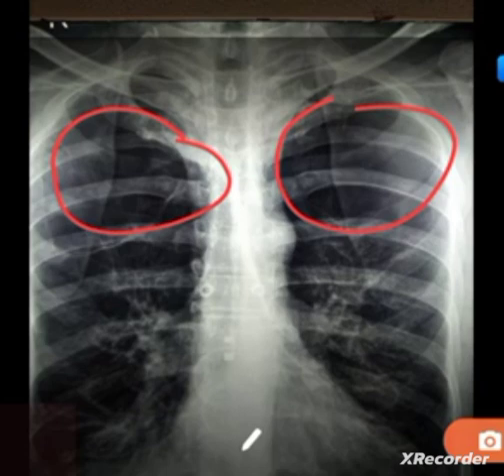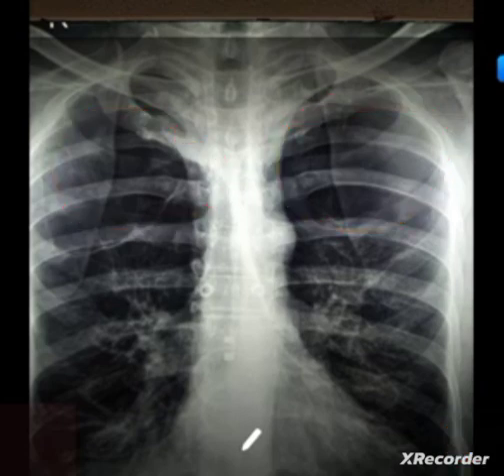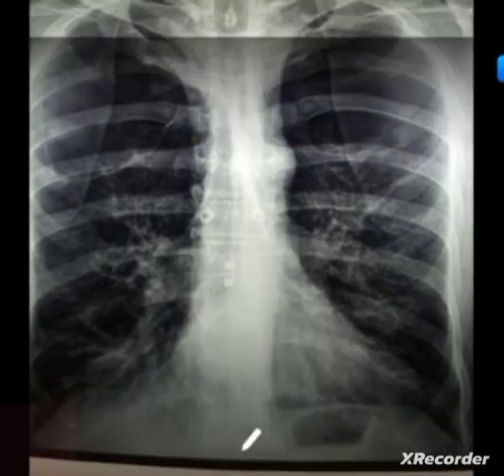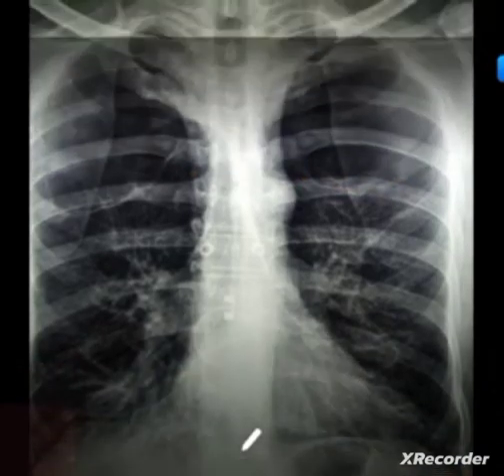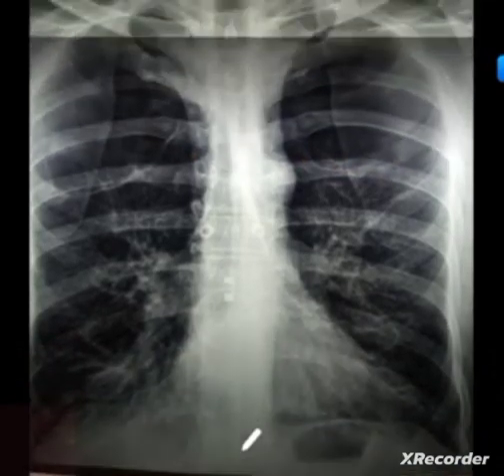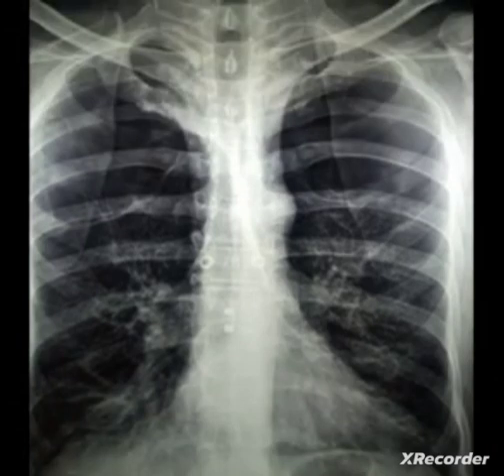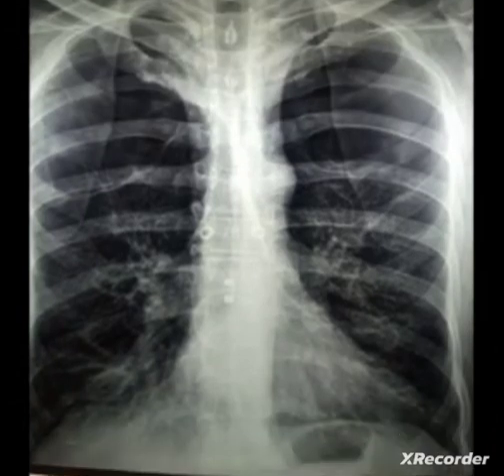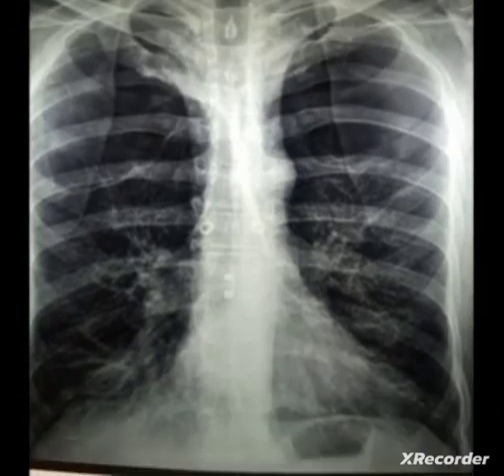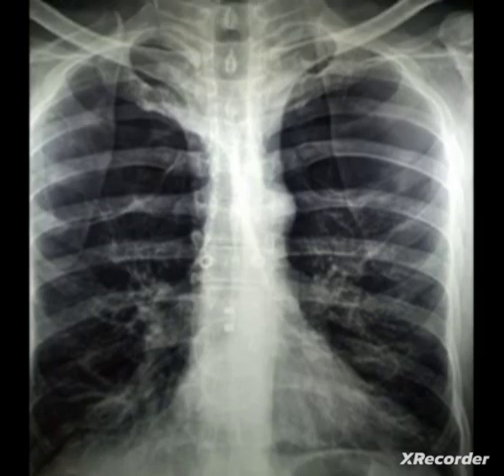So this is actually a case of advanced COPD. In early COPD, the chest X-ray is usually normal. In this case, the main pathology is emphysematous changes, and this is diagnosed as a case of COPD with bilateral upper zone emphysema.